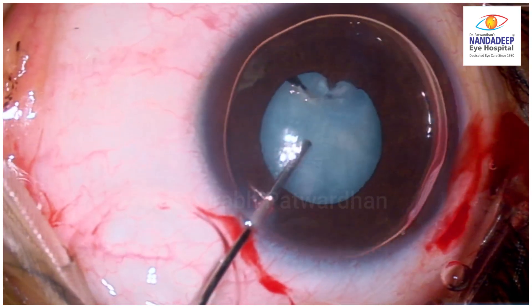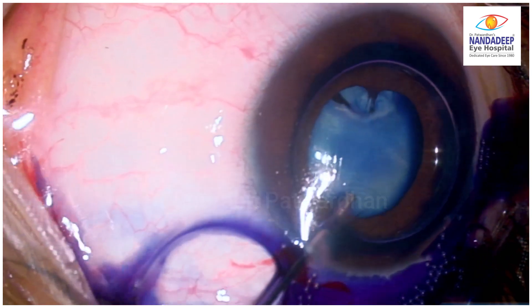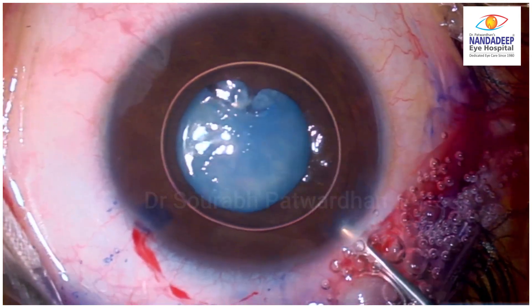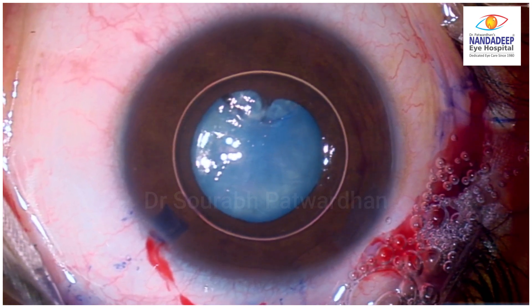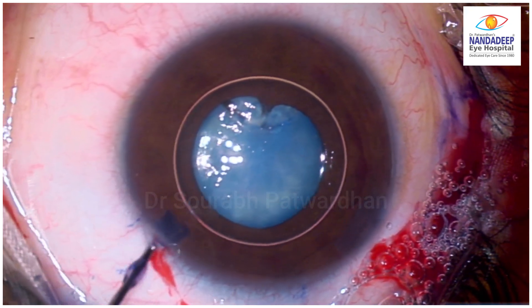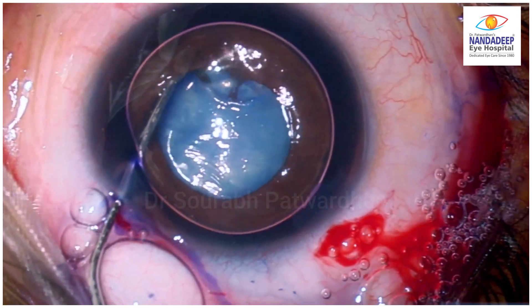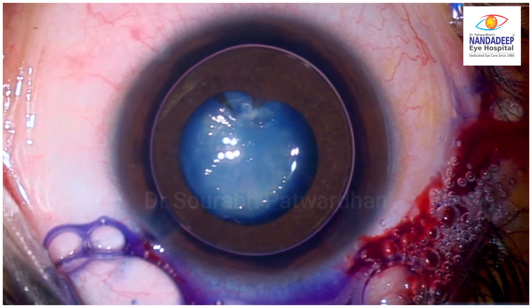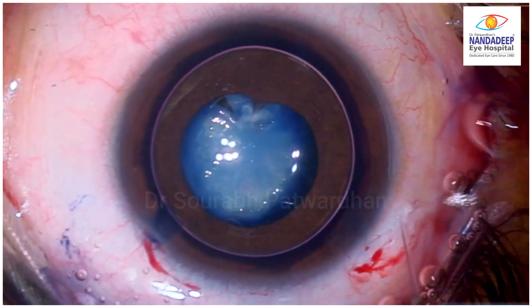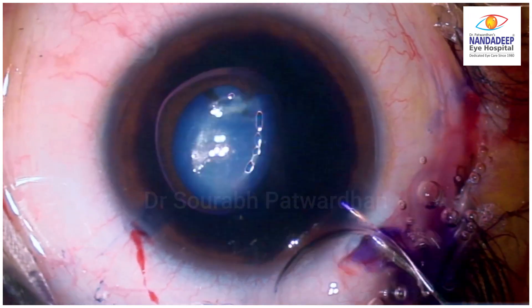It's an injury by wire that pierced through the cornea into the lens, and we don't know the status of the posterior capsule or even whether this tear has extended to the PC. So I made a scleral tunnel so that in case I need to place an iris claw IOL, I can just enlarge this and place the iris claw IOL, then suture it on the scleral side.